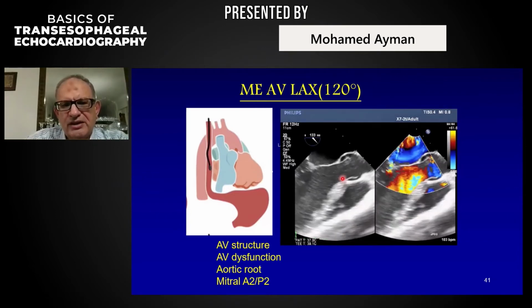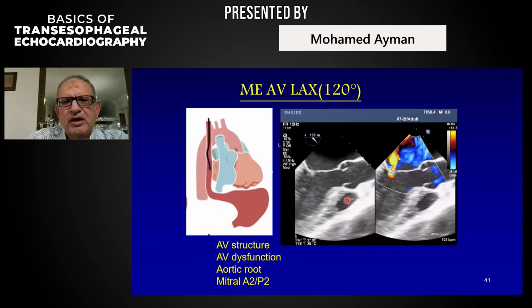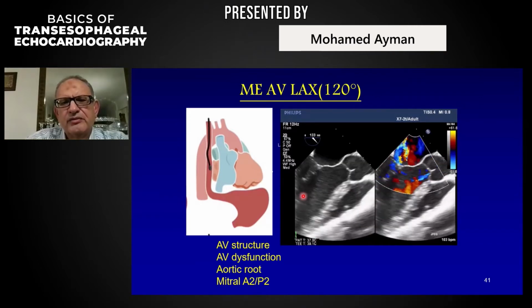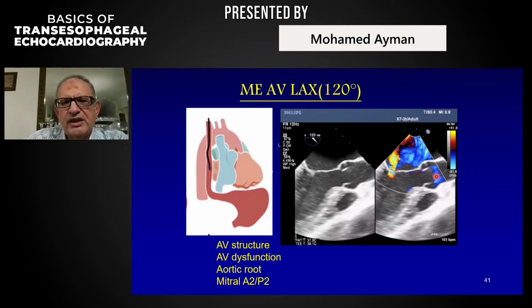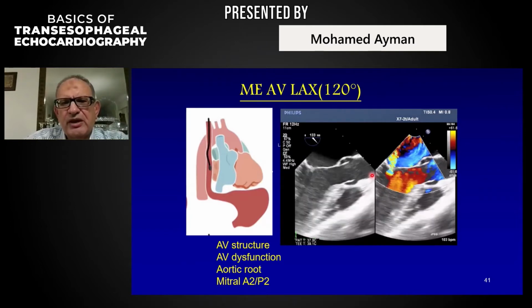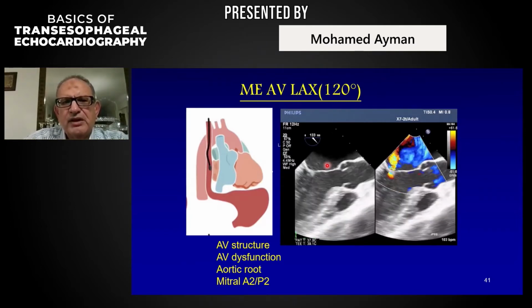So now you can see here the two aortic cusps, part of the right ventricle, the interventricular septum, and the mitral valves. So if there is any aortic regurg, you can see a backflow here. Actually, we have some mitral valve regurgitation, as you can see here.